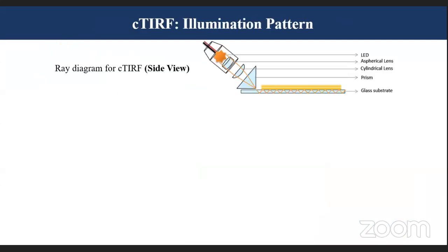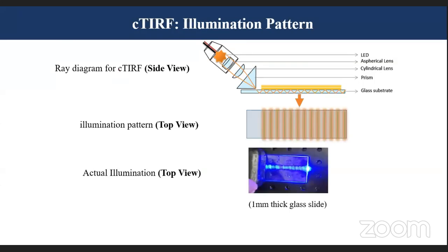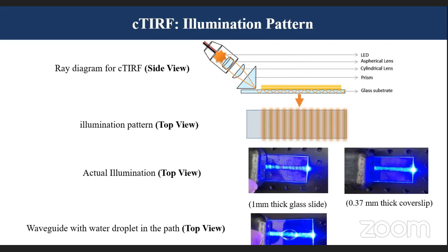But there was another challenge. I have generated this kind of waves, and I have shown that these are getting generated. They are not getting percolated even if I am putting in water, which has a refractive index of 1.33, and the refractive index of the glass is 1.5. So they are pretty good. However, putting all this setup into a cabinet or device was a challenge.